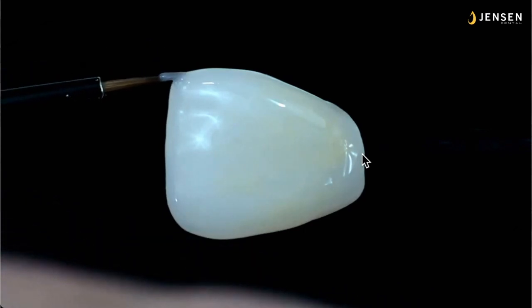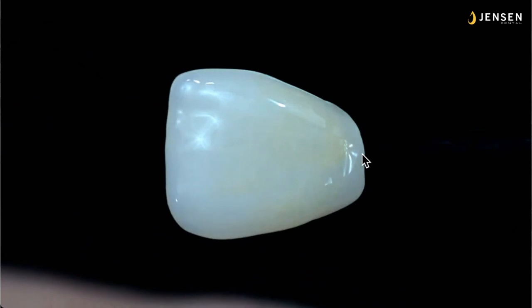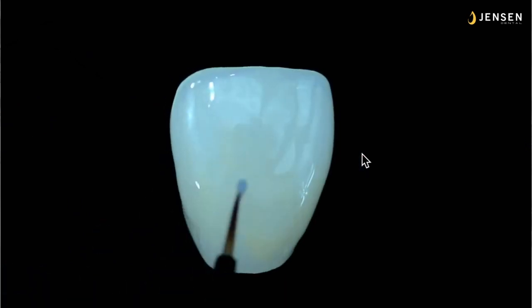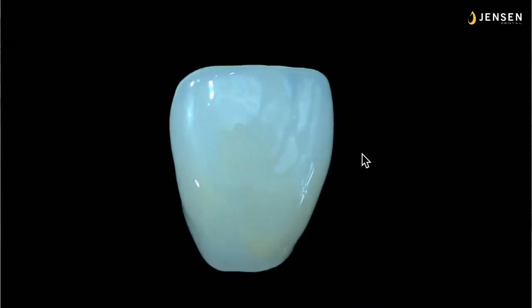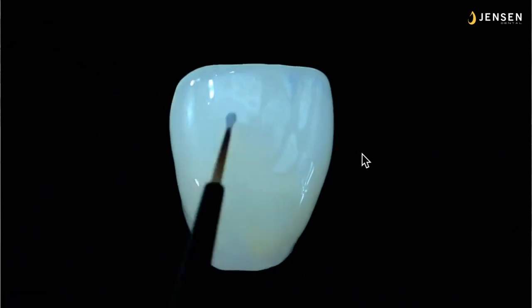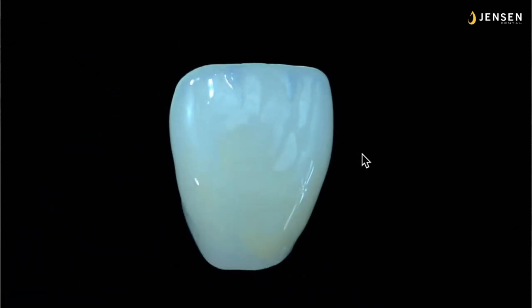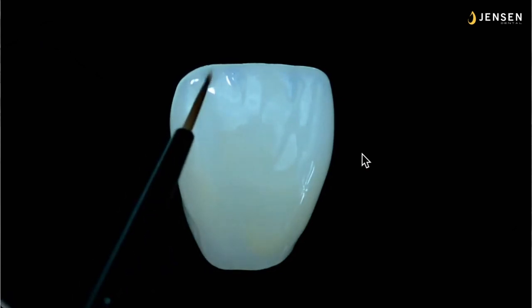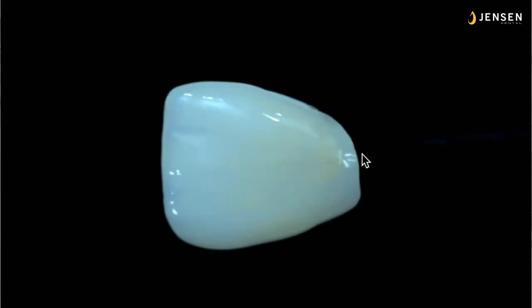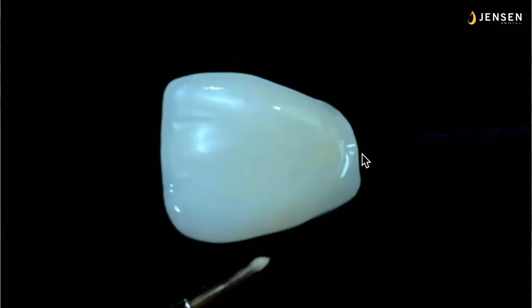Now there's paste glaze on this entire surface, so the minute the color touches the paste glaze, sticky likes to stick to sticky. Now I have my window above the incisal edge, so now I'm going to do some lobes here. I'm using the same storm. I get a little bit on the tip and I touch the blue-gray line I already have in a perpendicular fashion and I pull it back, just like a hot glue would string from a hot glue gun. I can take it and touch it and pull it back and it gives me a nice little line. Now if I find my lines are a little bit too thick, I can always clean my brush, get some glaze liquid in it, and dress up those lines.